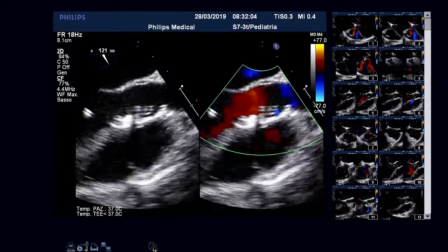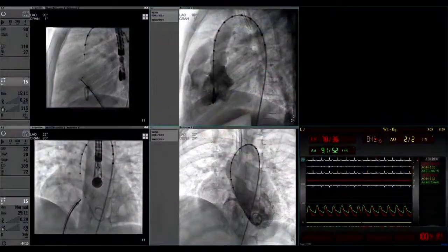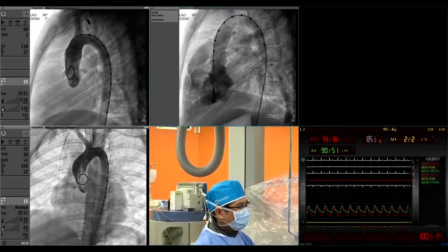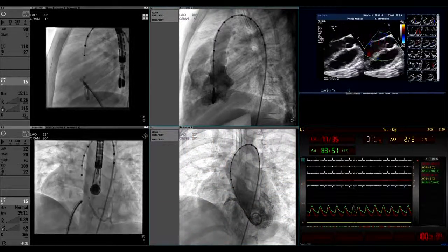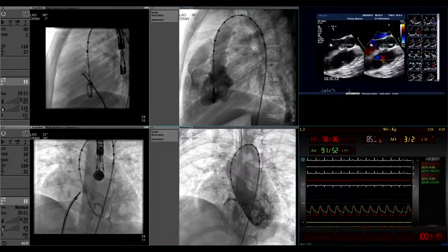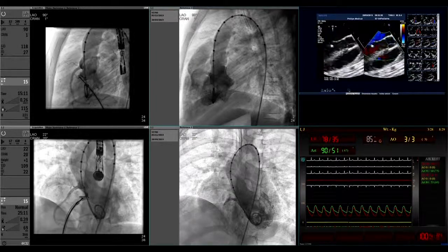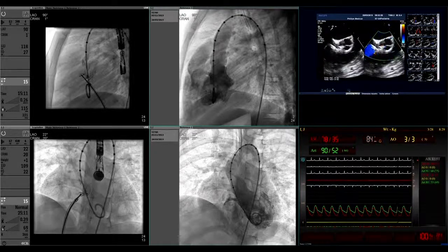Yeah. Next. We will review the angio. Previous. No, sorry. Previous. I like your Vietnamese hands. Yeah, you see now, it looks okay. Everything looks okay. But you see the left side is still moving together. And so I don't think it's safe. Next. And so I retrieve.